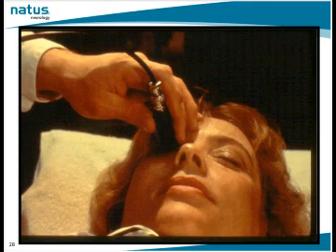All right, next approach is the transorbital approach, and you don't have to do these in this order. I usually start with the transtemporal approach, and then I go either to the transorbital or to the suboccipital, but for our cases here, we're going to go to the transorbital approach next. So in this situation, we're evaluating the carotid siphon and the flow direction in the ophthalmic artery, and we're going to place the transducer over the closed eye using a very light touch and very little gel.